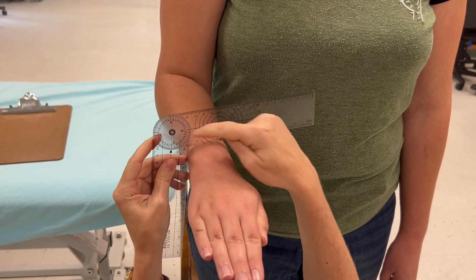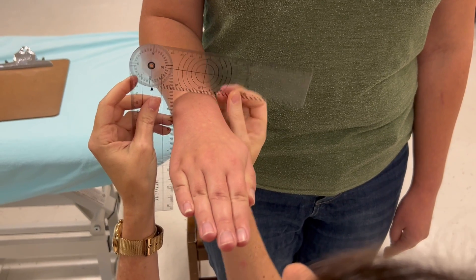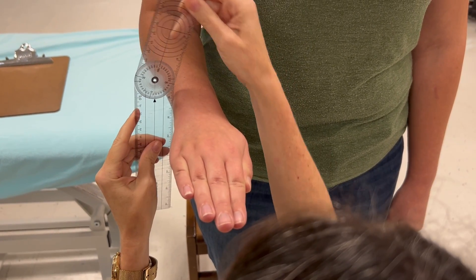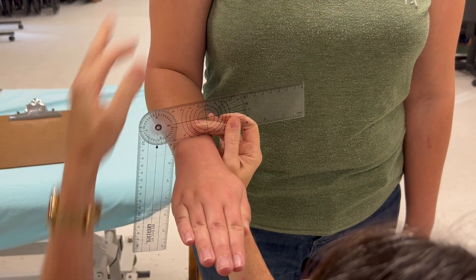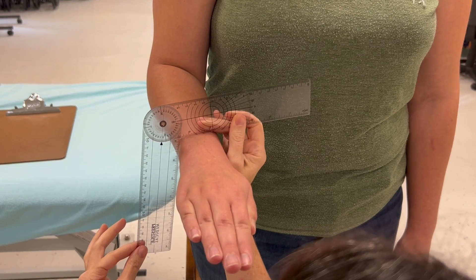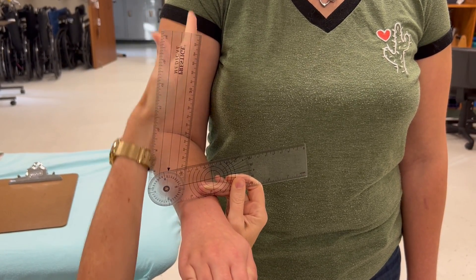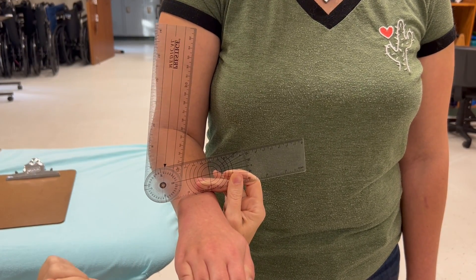The moving arm goes directly across both bones — not more on the radius or more on the ulna, but equally across both. The stationary arm is parallel to the anterior midline. I'm getting about 78 degrees. You can hold the moving arm down or up — it's probably easier to hold it up because it's closer and you can get a better view of whether it's parallel.